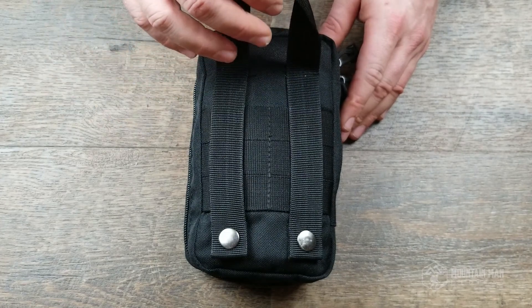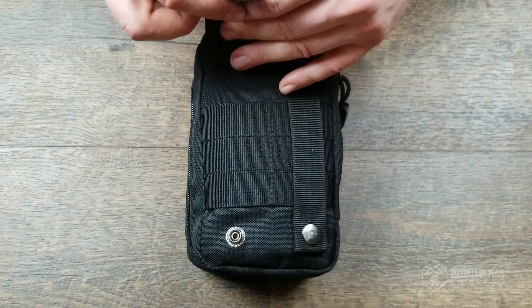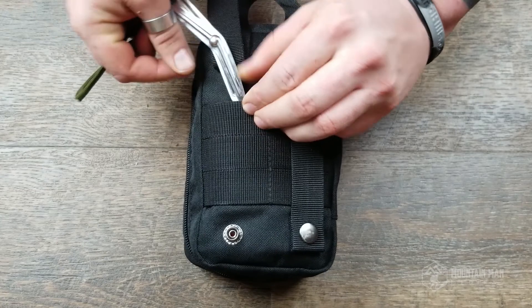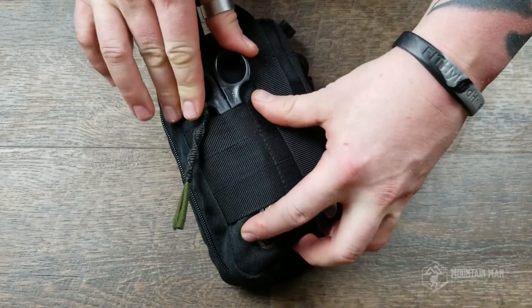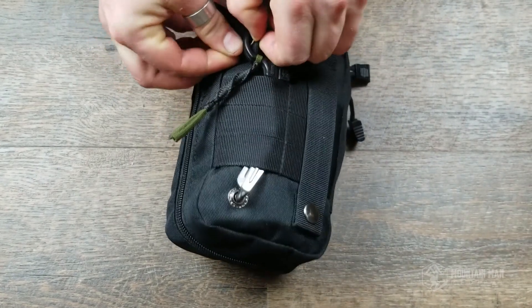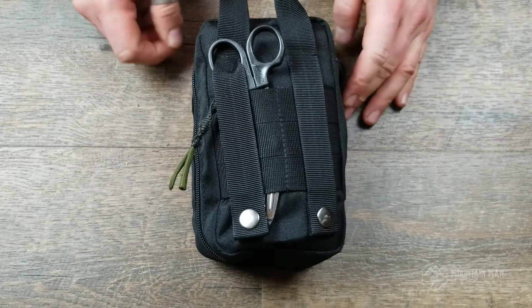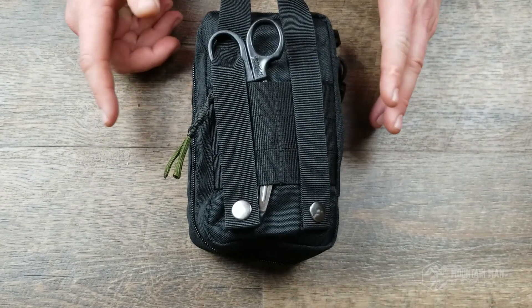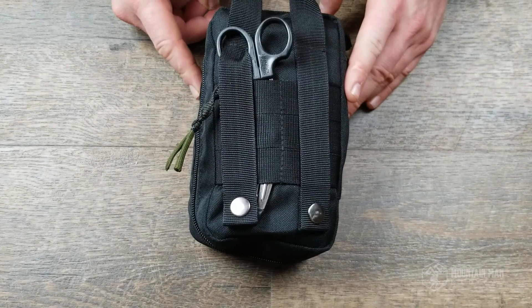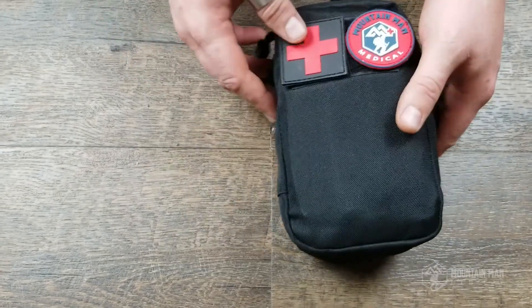On the back we've got MOLLE so you can attach it to your war belt, your backpack, wherever you have MOLLE. I also like to keep shears on the outside — you just run the strap through and secure them in place. That frees up space inside your bag and leaves the shears quickly accessible on the outside so you can cut people out of car seats, seat belts, or whatever you need.